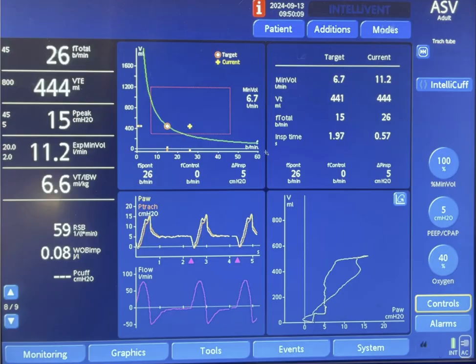So let's take a look at this patient. Once we set the patient with these settings 100% here this is determined we get this graph. This graph will plot the tidal volume against the respiratory rate and you get this green curve.